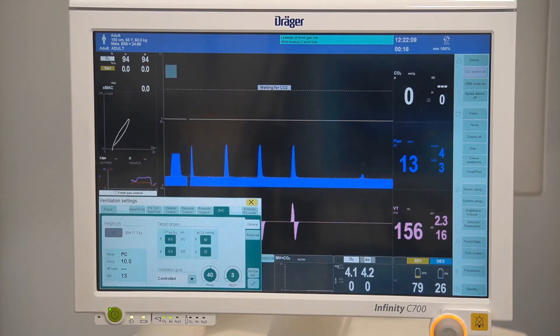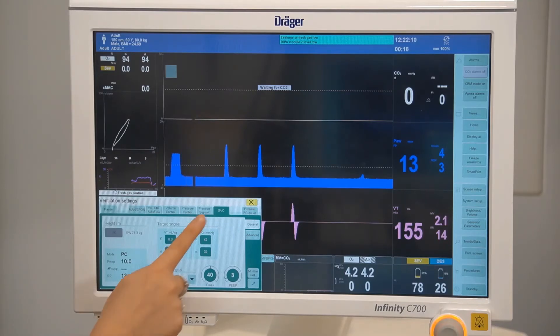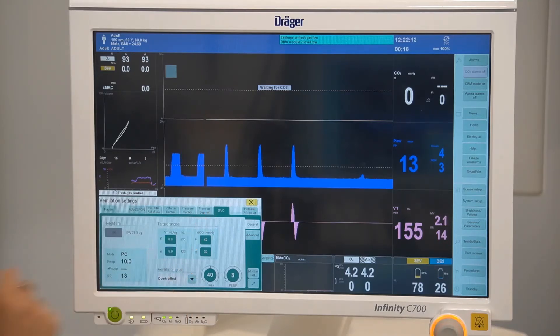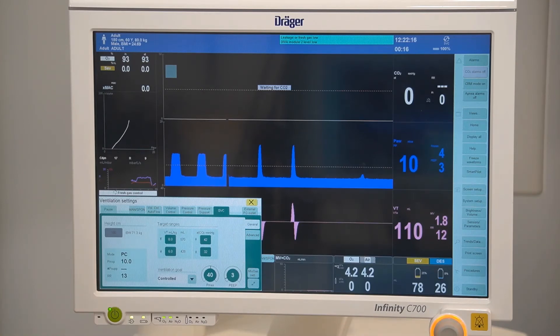You have the option to select smart ventilation control on the Zeus IE. Please refer to the advanced features video for more information.